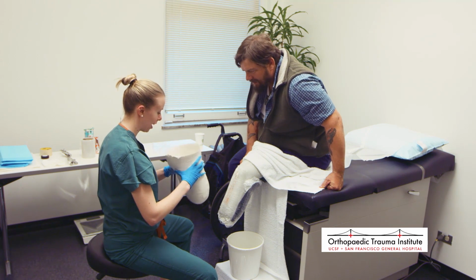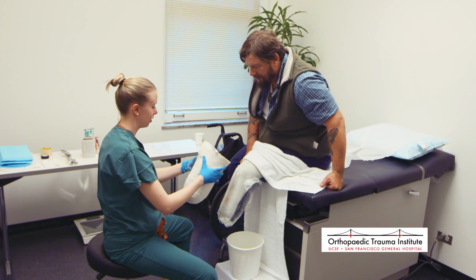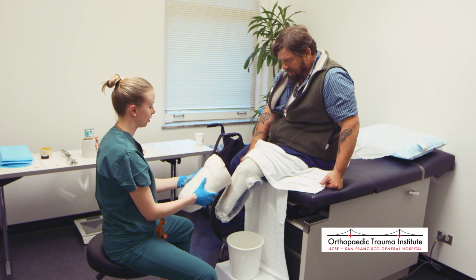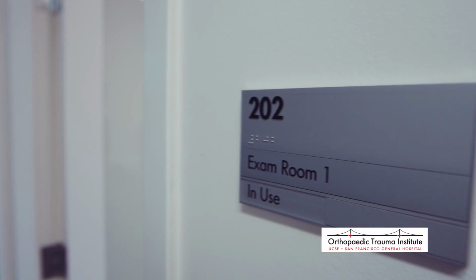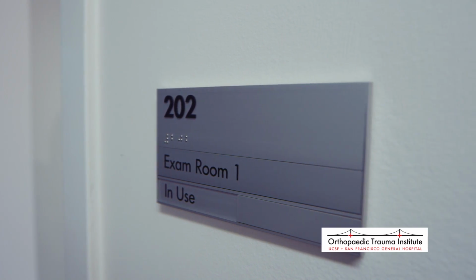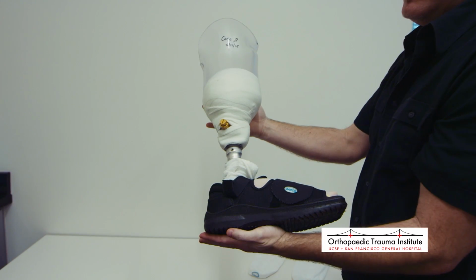As we saw in the first section, the casting of a patient's residual limb is integral to the process of creating the test socket. A week after Don's residual limb was cast, he returns to try on the test socket that Hannah has created for him. Here's Hannah explaining that process.